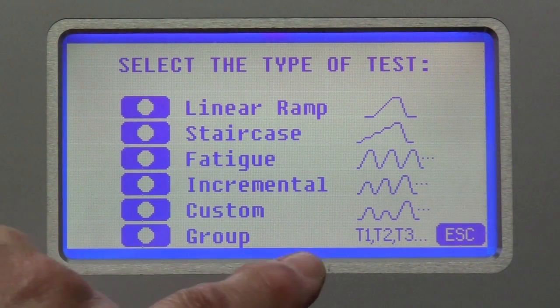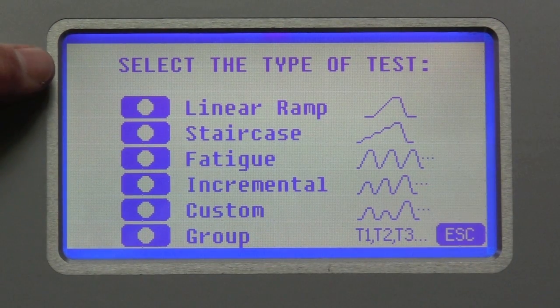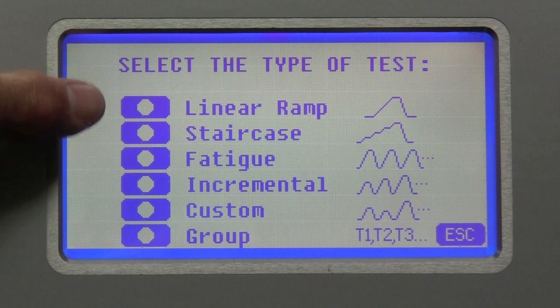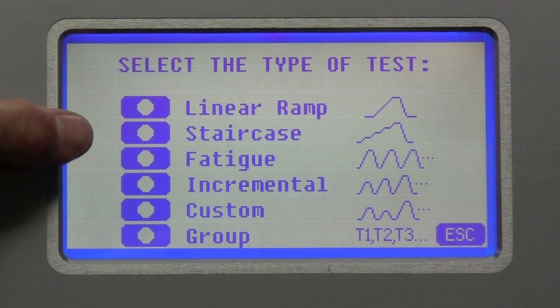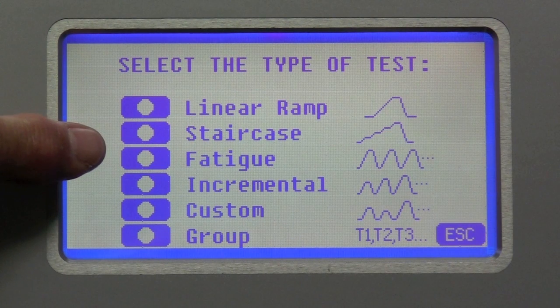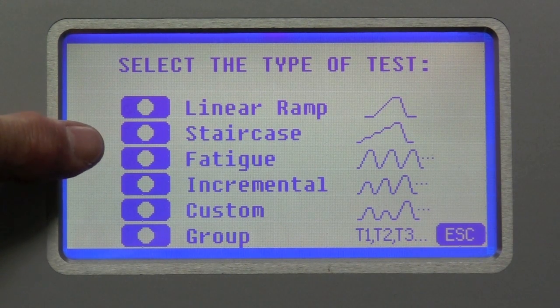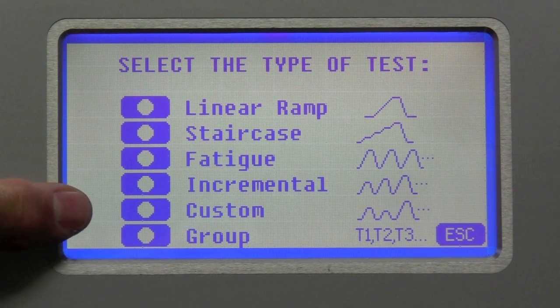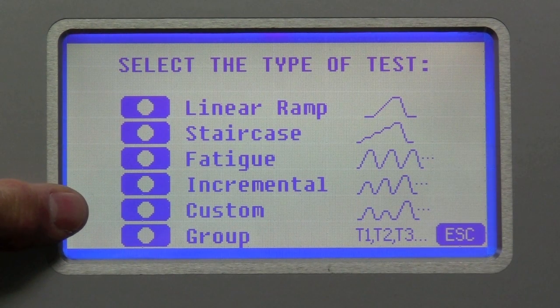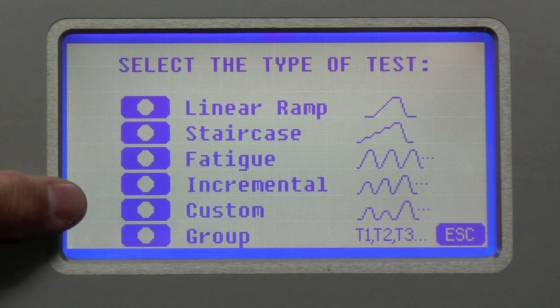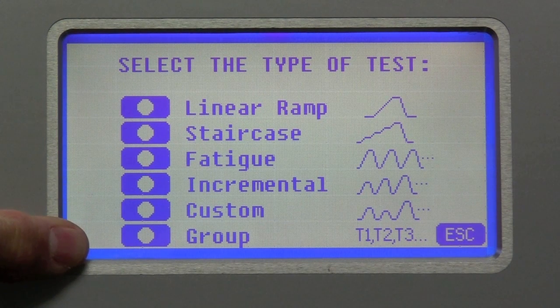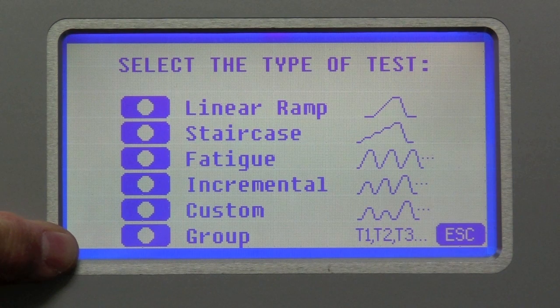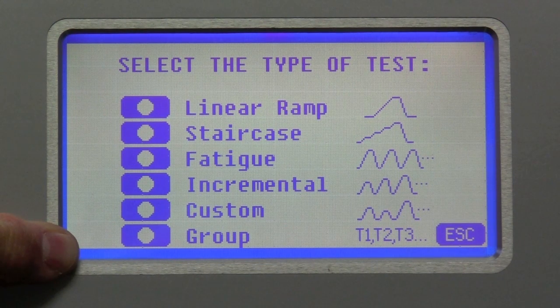And here it gives you an indication of the types of tests that can be created and stored in the HBLT. A basic linear ramp. A staircase that gradually increases in pressure. Fatigue, which repeats the same pressure over and over. Incremental, which cycles and increments the pressure up. Custom, where you're allowed to create tests with up to 100 discrete pressure values. And a group test, where you can link up to 10 different tests together that will run automatically and sequentially.